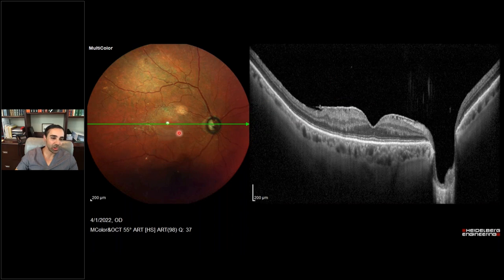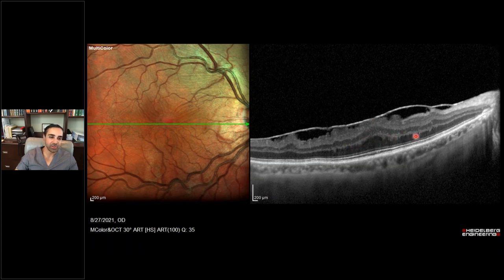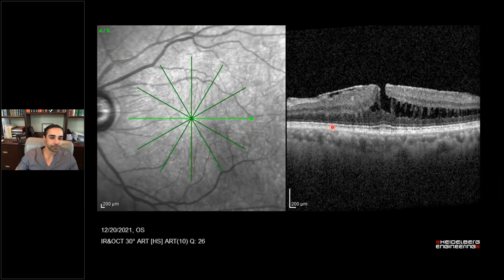Here's another epiretinal membrane — slightly elevated, exerting traction, with loss of foveal contour and distortion of the outer retinal layers. This patient had vision decrease to about 20/70. You can see retinal striae on the multicolor fundus photo corresponding to inner retinal folds on the OCT. Another epiretinal membrane with inner layer hyperreflectivity, a partial-thickness lamellar macular hole, and cystic spaces in the temporal macula.